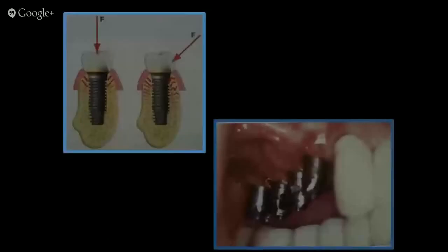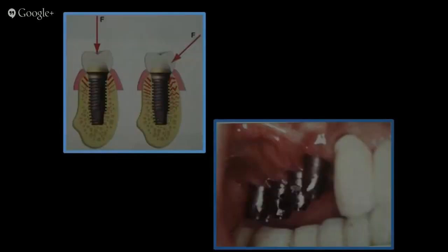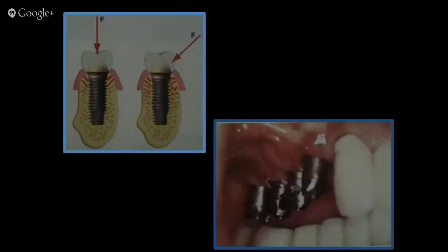In most instances, they find the bone along the palatal side, and implants are tilted to that angle. Then you have angled abutments, customized abutments beyond the 25-degree acceptable mark. Great, but do we have long-term success? Are there studies which show that 25 years down the line, such things have stayed in the mouth without complications? No. So we have to understand that implants are prosthetically driven. Surgical methods can get you the osseointegration, but if your prosthetics are not properly planned, you will encounter failure. Not today, but definitely tomorrow.